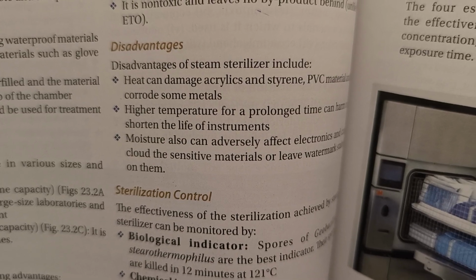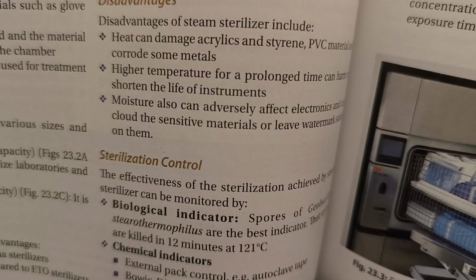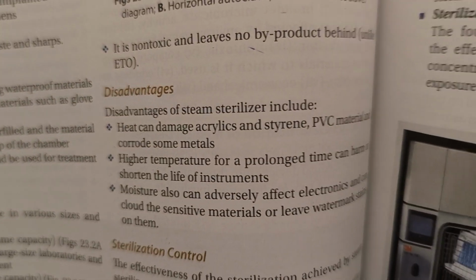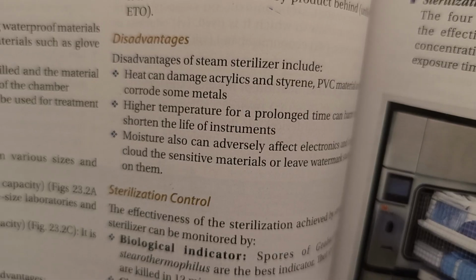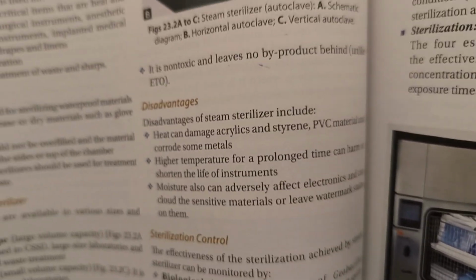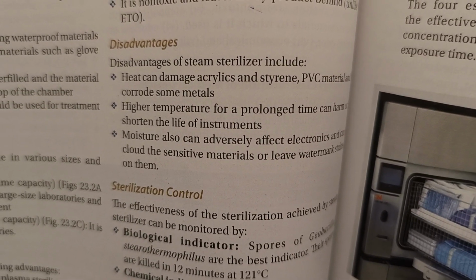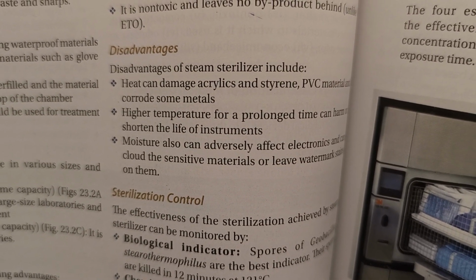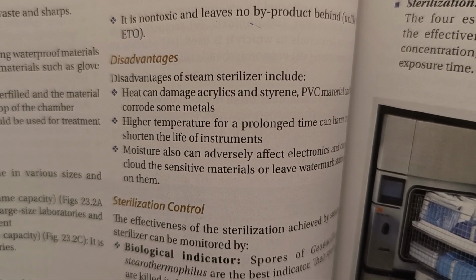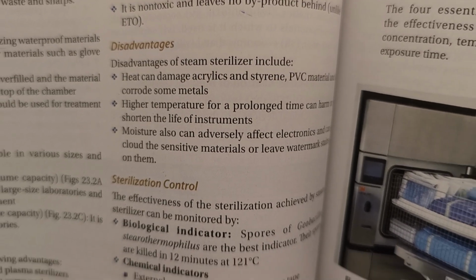Disadvantages of steam sterilizer include: heat can damage acrylics, styrene, and PVC materials and corrode some metals. High temperature for a prolonged time can harm or shorten the life of instruments. Moisture also adversely affects electronics and can cloud sensitive materials or leave watermark stains on them.